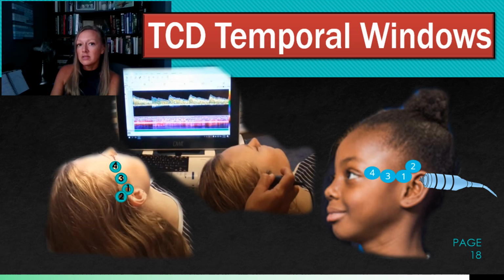From there, sometimes you are angling slightly superiorly to identify your ACA, and then you are rotating your probe almost as a small comma posteriorly and inferiorly to identify your PCA. If you are obtaining your terminal ICA, you will angle inferiorly from your MCA-ACA bifurcation.